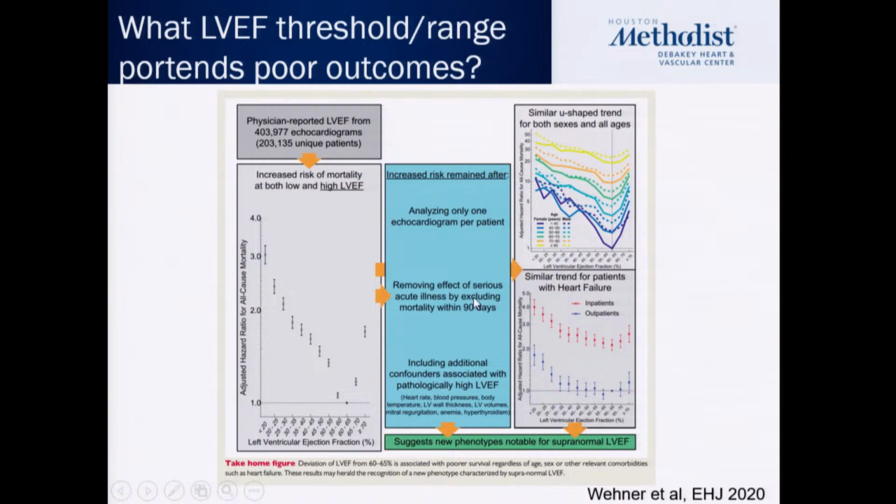And to give you the usual profile of these patients, most of them are older patients, or more of them are older women also, who tend to have smaller LV cavities, and as a result, you can estimate that their stroke volume is probably lower, and their ejection fraction is hyperdynamic to maintain their LV stroke volume. In this study, they did a whole lot of adjustments to try to correct for that or control for that.